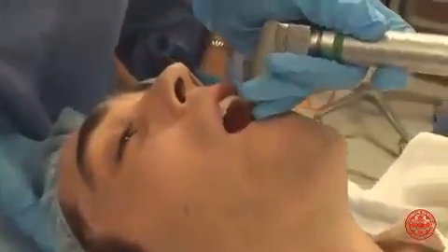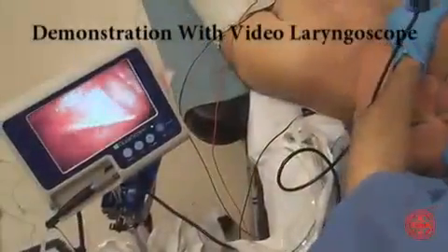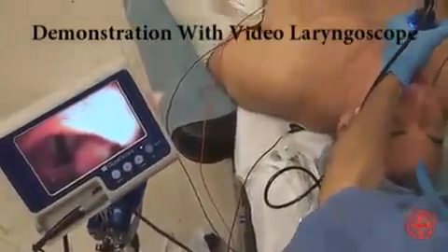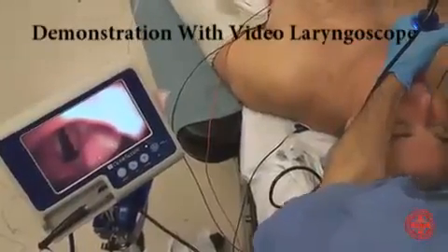The tip of the blade is advanced towards the base of the tongue until the epiglottis is identified. By placing the curved blade in the vallecula and pulling forward and upwards at a 45-degree angle, the epiglottis moves anteriorly, revealing the glottis. The endotracheal tube is then advanced with the right hand into the trachea.